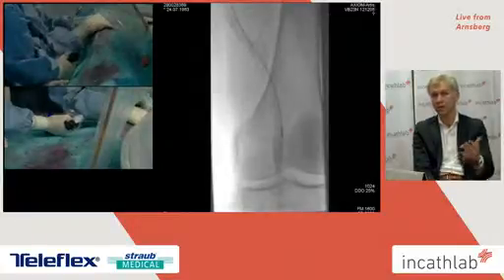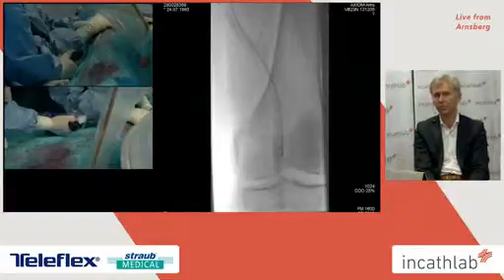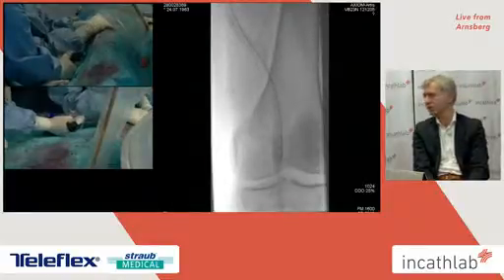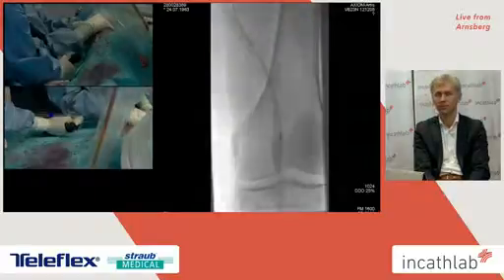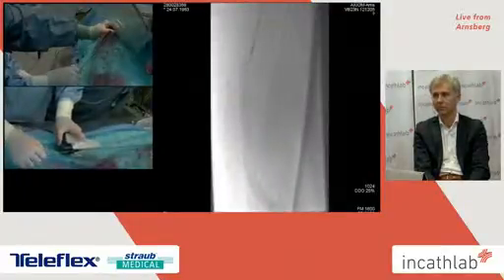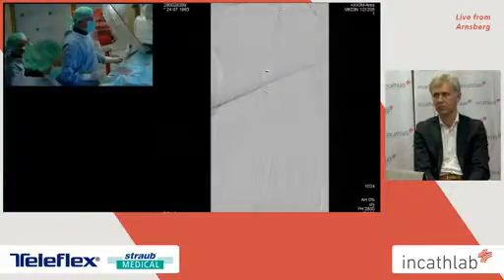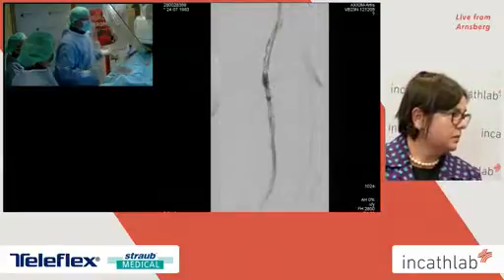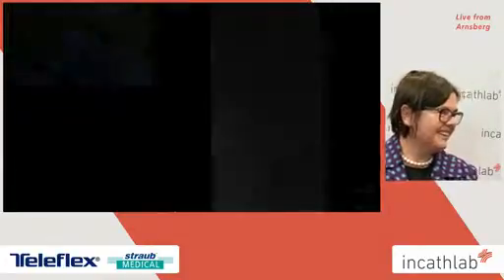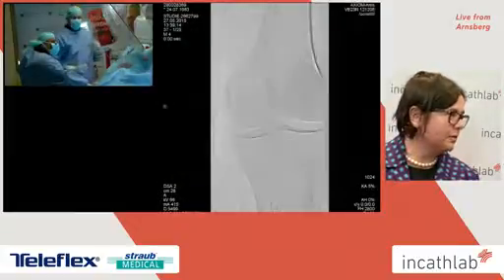But just for bypasses, I think Rotarex is probably the most elegant option because it's quick and fast. Yeah, I would agree, because thrombolysis usually takes a very long time in bypasses. So you can start with that if you want to stay a little bit cheaper. But on the other hand, I think at the end of the day we'll end up with something like that.